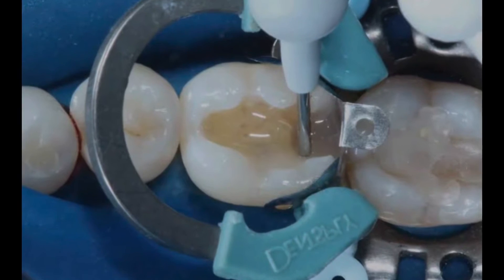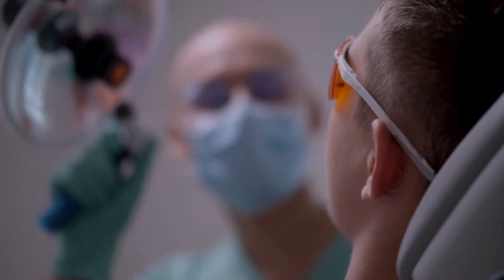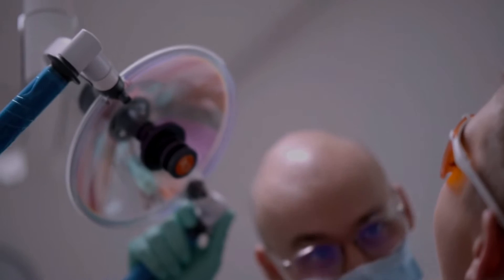Hello everyone. Creating an adequate proximal contact is one of the greatest challenges ever encountered by the experienced clinician.